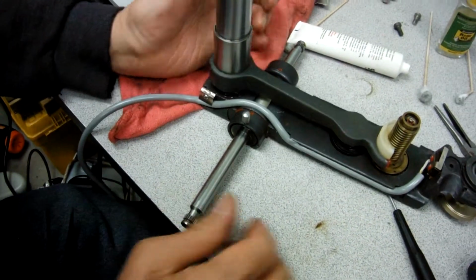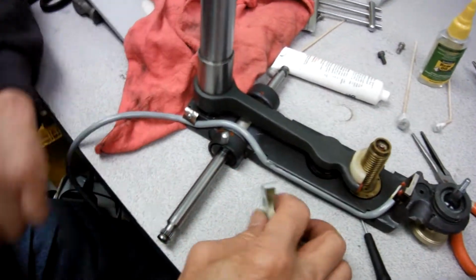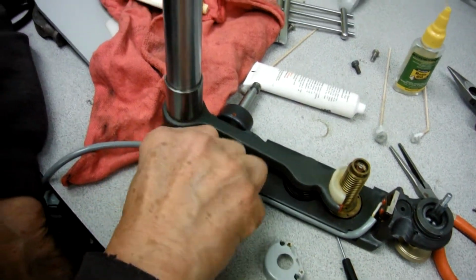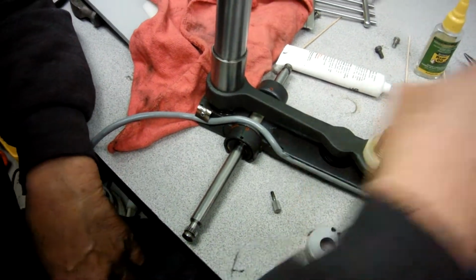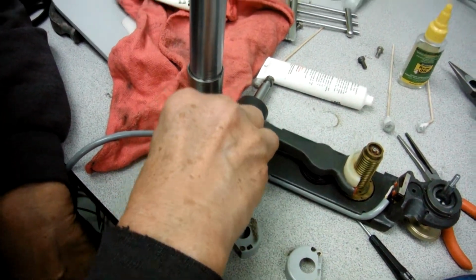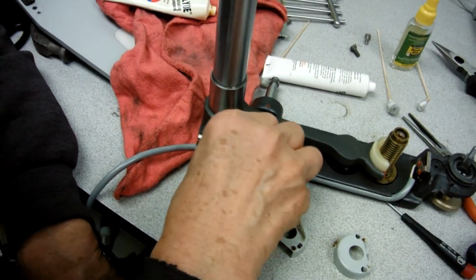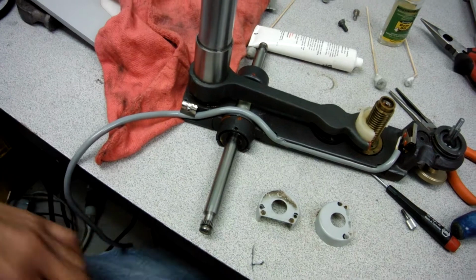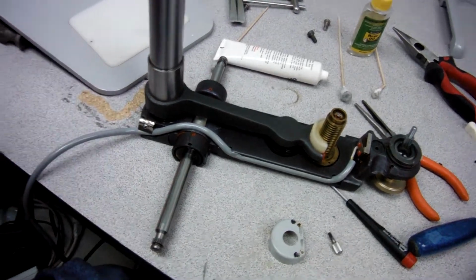And after you put this one in there, good, just leave the shaft in there and lock it back, and then you can put the cover back in place. But what I do is, this is how you put the press piece in there, and then you can remove that, because you have to put the cover back in place, because the knob has to go through the cover, okay? But the way you put it right here like that before, it's easy for you to align everything. Because if you put the cover back in place before you align them, it's going to be hard for you to see anything. So after that, you remove the knob, and then you clean your cover.